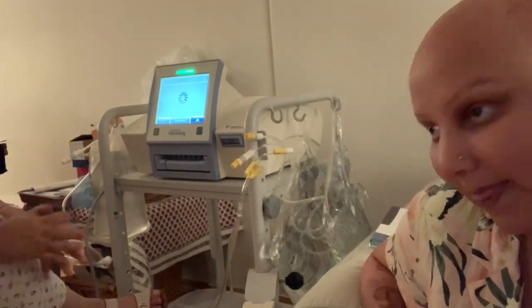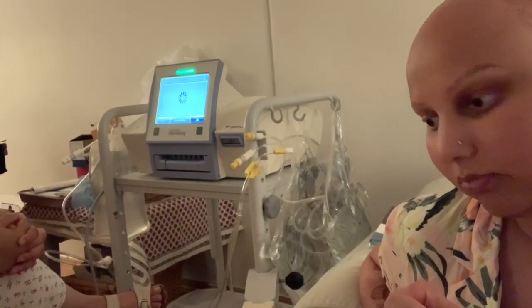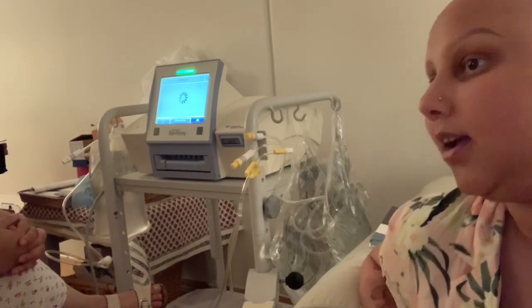So I'm basically hooked up to this machine for seven and a half hours throughout the whole night.